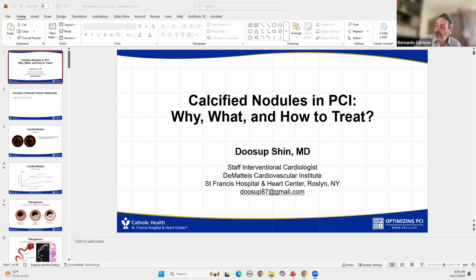We presented the preliminary results at TCT of our study called Cardiac. Daniela presented it: severely calcified lesions treated with atherectomy or IVL plus DCB, no stent. It's a small study, 121 patients, and I don't currently remember the exact number.